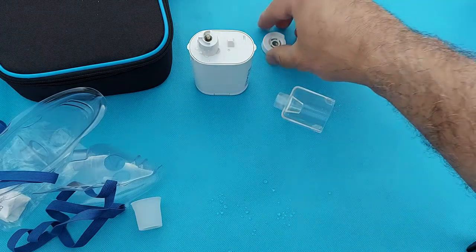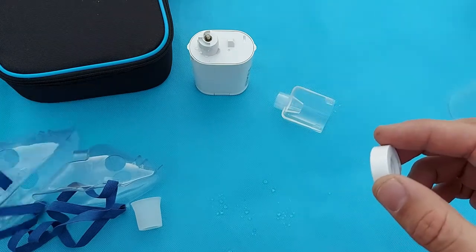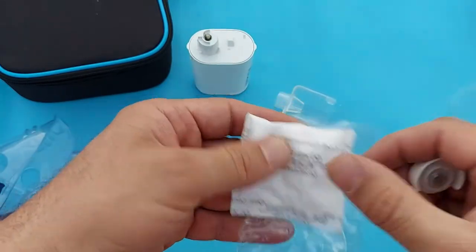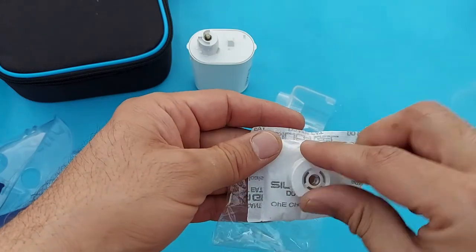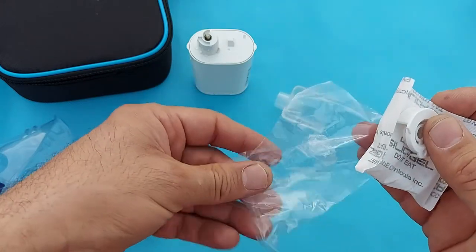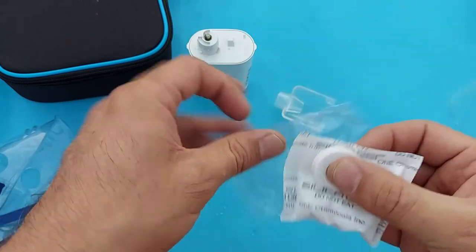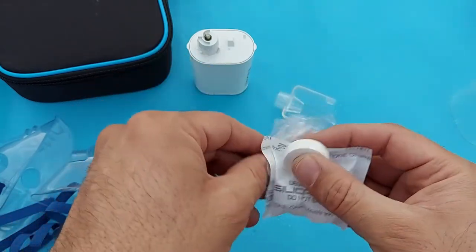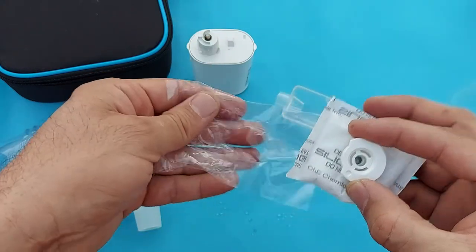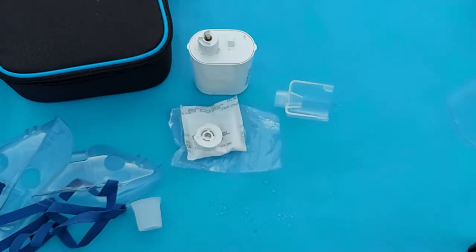This is the important part of this device — the mesh cap. You will take good care of this one. Always keep it beside these silicon crystals, which will remove any moisture from the mesh cap. Make sure that when you are using medication there may be a little medication around the mesh cap — you should only wash it with water. Do not use any alcohol swab, tissue, or cloth for cleaning the mesh cap. Only wash it with water and dry it in the air.